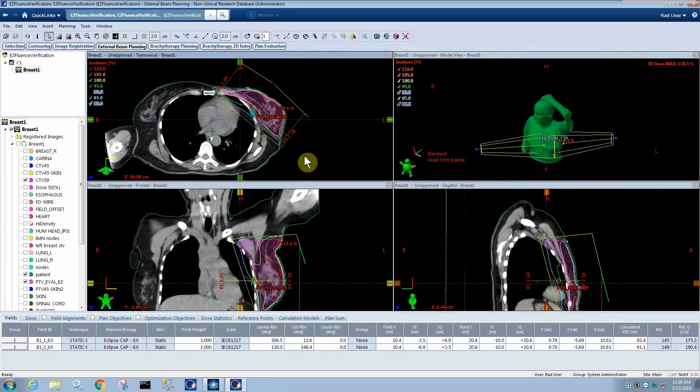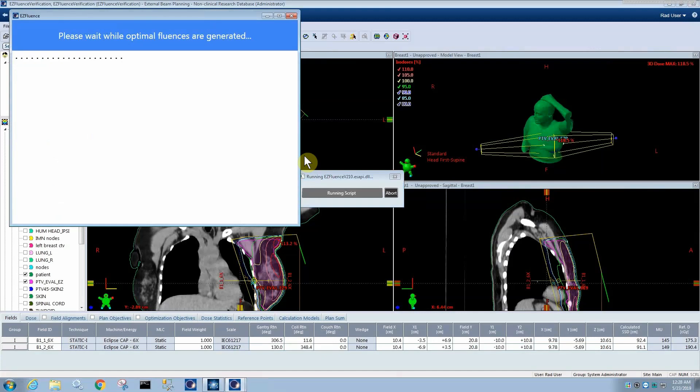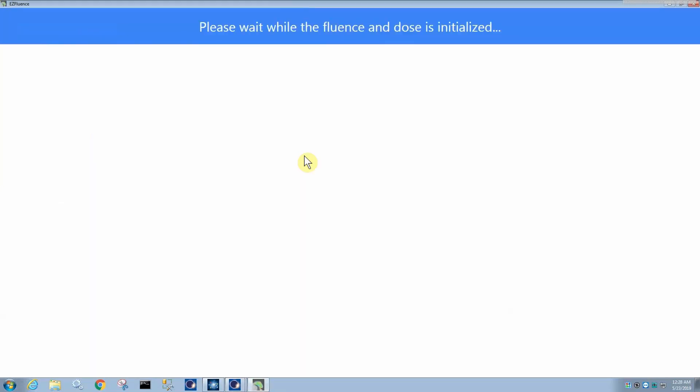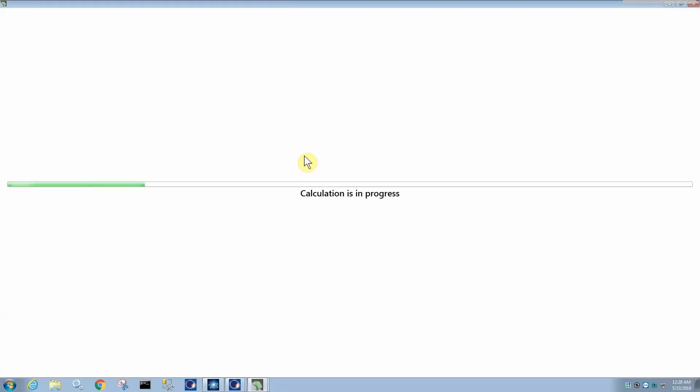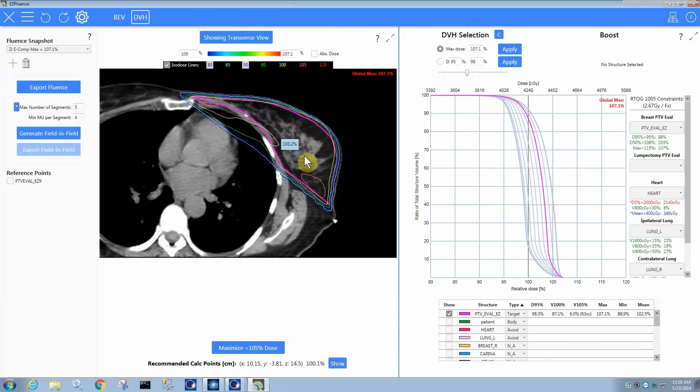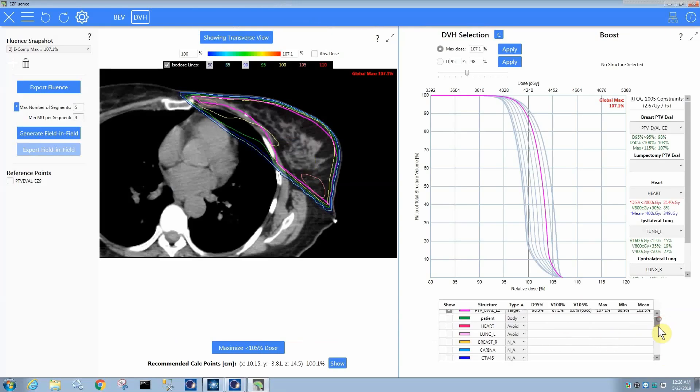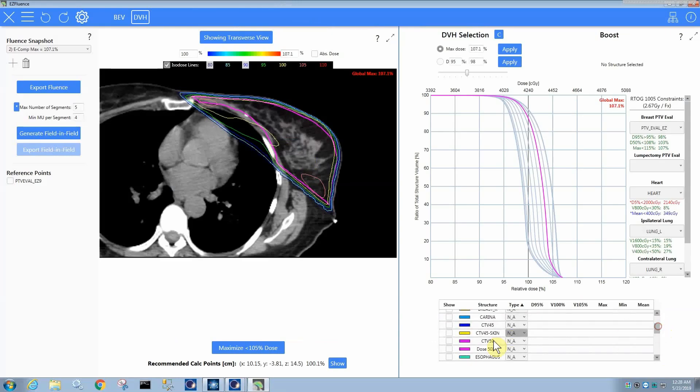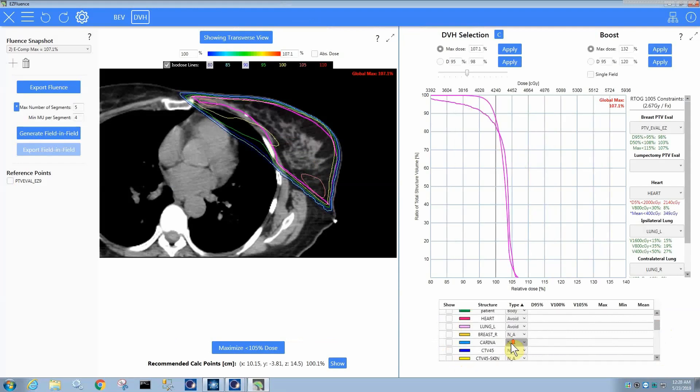EasyFluence version 2 has the ability to boost structures. So what we can do when we run EasyFluence... So now we have a structure called CTV59 that we want to give an integrated boost to.